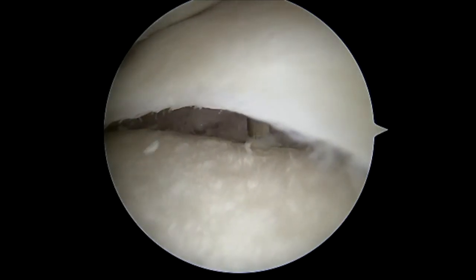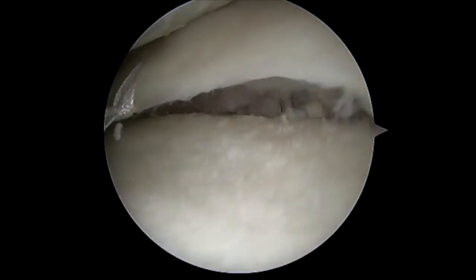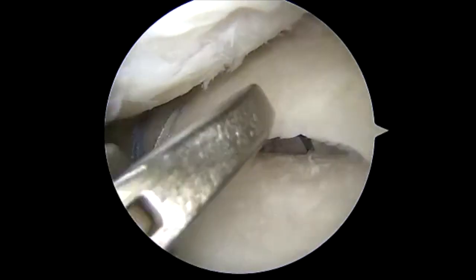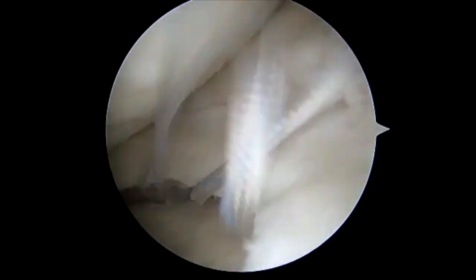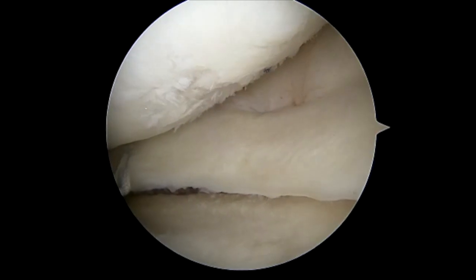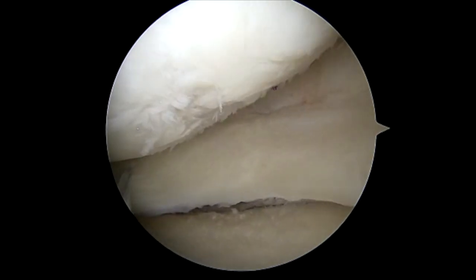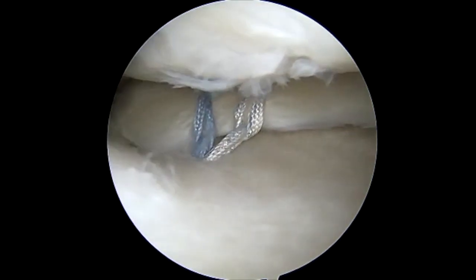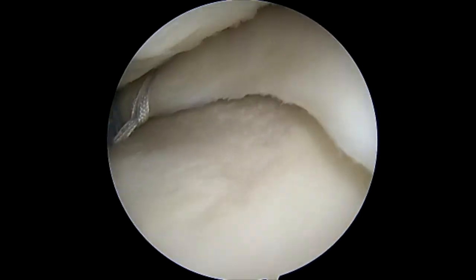You can see we drill just off the medial plateau using the cannulated metal guide system. Following this we use the passer again, grabbing from the medial portal, and we pass the stitch. As you can see, we are able to pull the meniscus down tightly and pull it over roughly two or three millimeters onto the plateau. This will not only improve our biomechanical strength of the meniscal root, but more recent data demonstrates this may actually reduce extrusion, which can be helpful in these patients — this one is already starting to have some grade two changes of her cartilage.